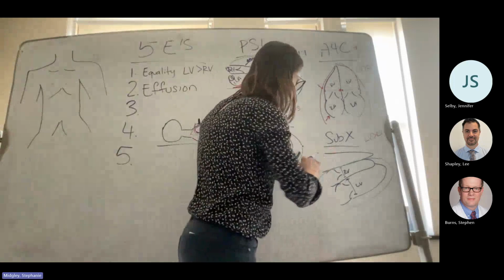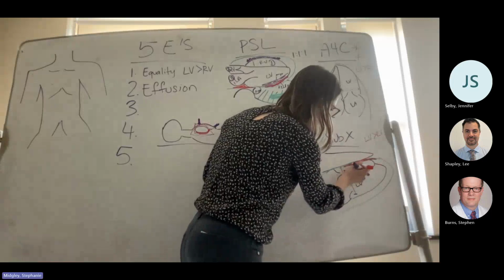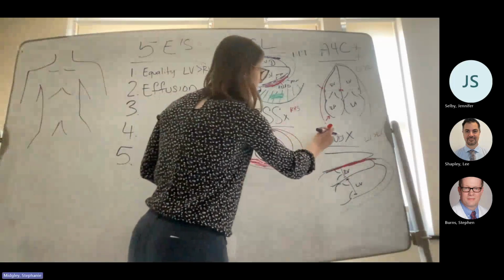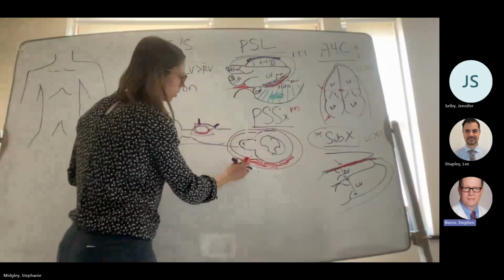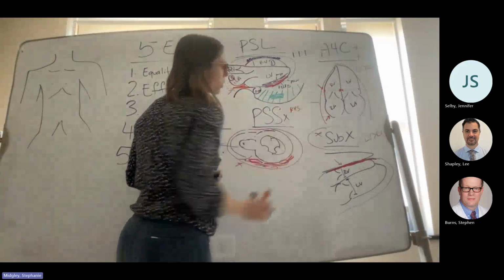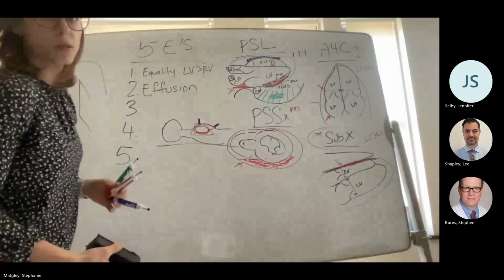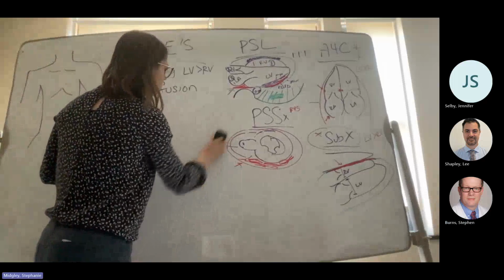So for this guy, when I'm looking for pericardial effusion, I'm looking at the top of my screen. You guys understand that? So subxiphoid is my only special one where I'm looking at the top. Everything else, I'm looking at the bottom. And then my apical 4, I'm just focusing on what's going on my right side. Any questions on effusion? No. All right, awesome. All right, next one.